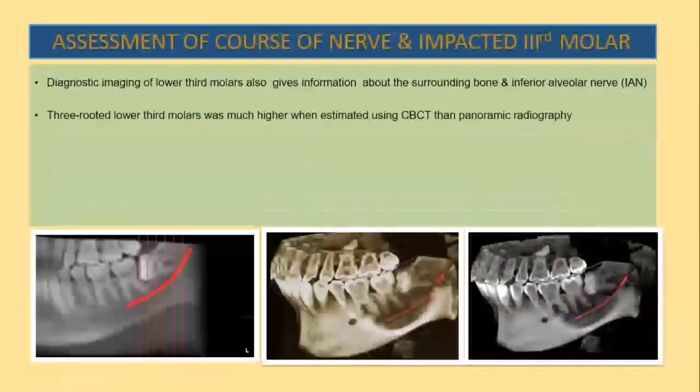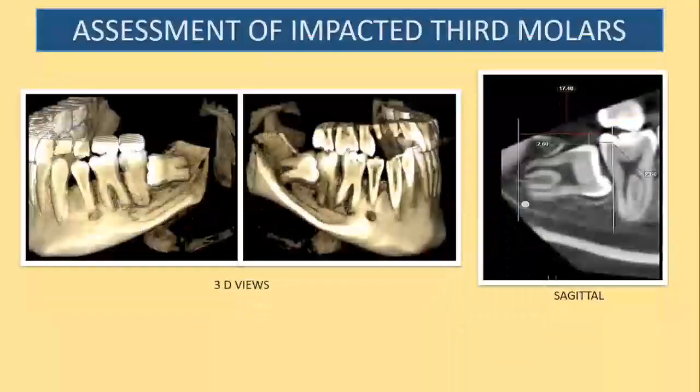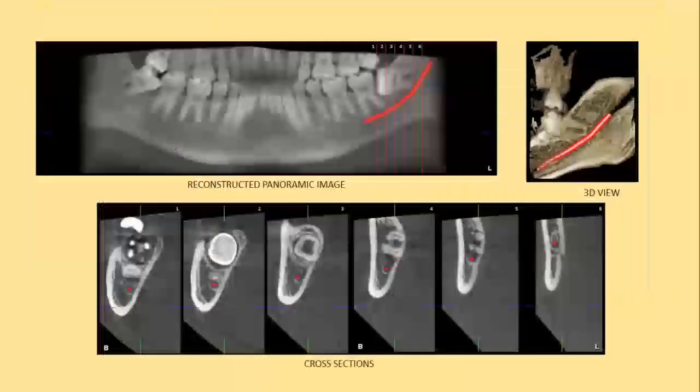Now, of course, for impacted molars, I mean, surgeons, third molar surgeries will help you. You could actually scan the images, and it will literally show you where the tooth is positioned, right? You can actually literally see. Also a great education tool for patients. This is showing you again the canal, which is marked here, and you actually trace the canal on the cross sections.